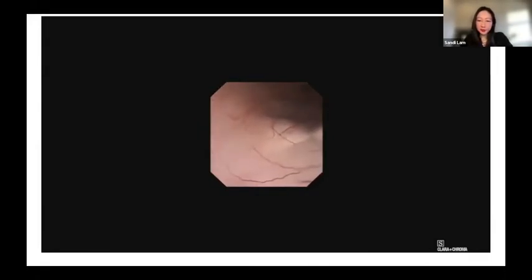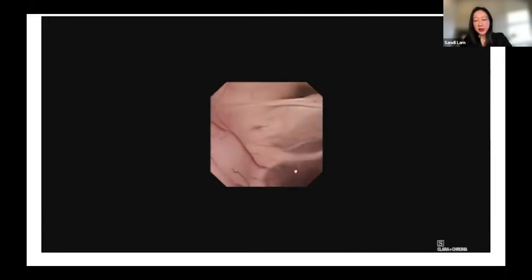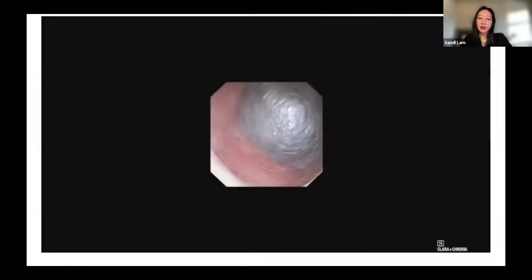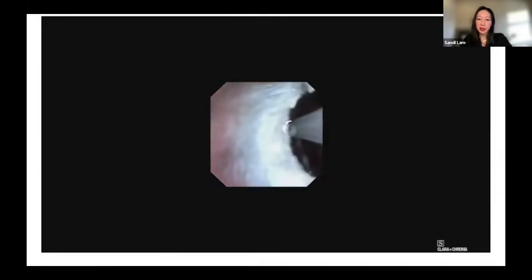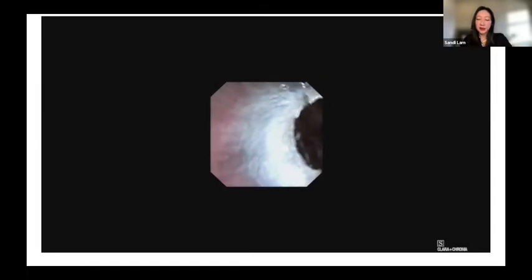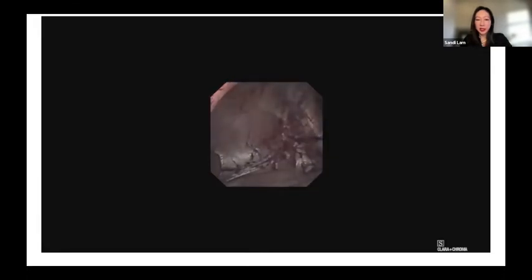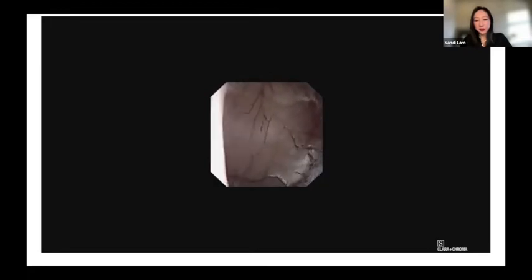We would look at the floor of the third ventricle first, and then identify all of our anatomy. I was curious about that dilated fourth ventricle and dilated aqueduct. So here I went through the aqueduct with a flexible endoscope and I'm able to see that cyst. This is that cyst wall bulging right up at us. Here I'm making a hole in that cyst with the flexible endoscope, being careful to navigate into this area. And that's a beautiful view of that arachnoid cyst in the fourth ventricle.